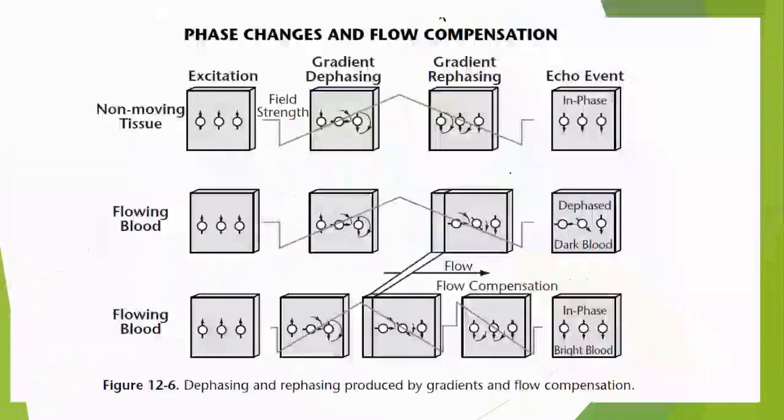What is the topic of phase contrast? Phase contrast means that you do something based on the movement of blood flow. In this context, what does this mean? Essentially, it refers to the technique where the movement of blood flow is analyzed to provide more detailed imaging. This method allows for a clearer understanding of how blood circulates, which is crucial in medical imaging.